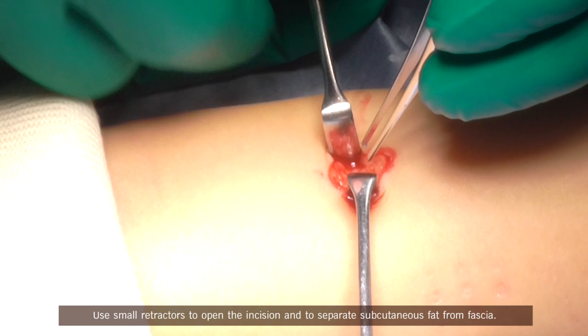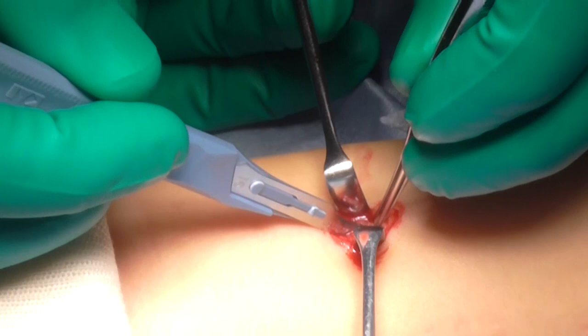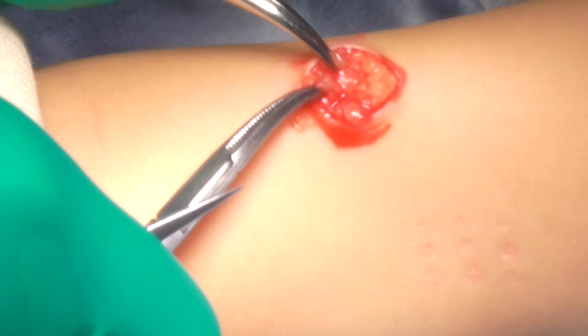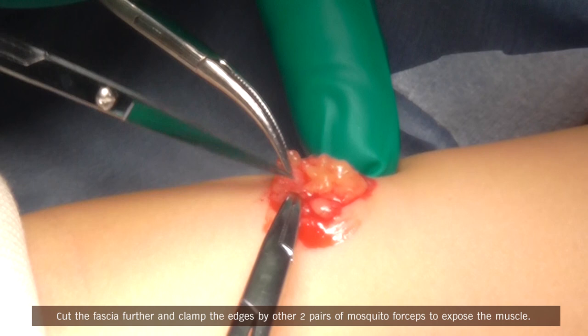Make a small incision on the fascia. Clamp the edges of the incision with a pair of mosquito forceps. Cut the fascia further and clamp the edges with two other pairs of mosquito forceps to expose the muscle.